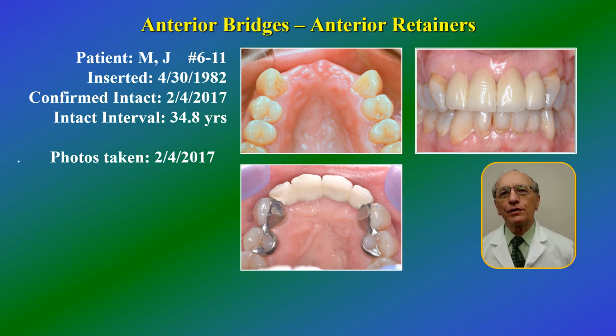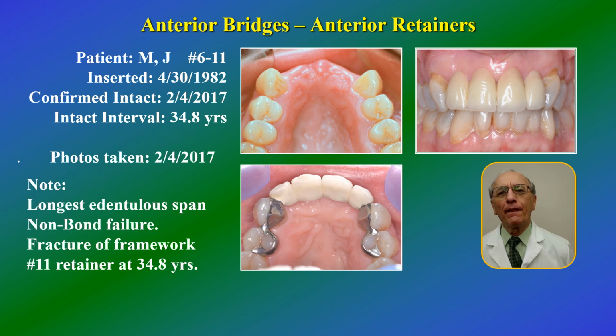Consider that the retainers directly adjacent to the 4-tooth pontic segment would predominantly absorb and resist the occlusal forces and be the first to fail. The second retainer on each side can be considered to provide periodontal support instead of retentive support, or the second retainer may prevent tilting or drifting of the prosthesis forward. Double abutment tilting would require bodily movement of both splinted teeth, which would not likely occur.